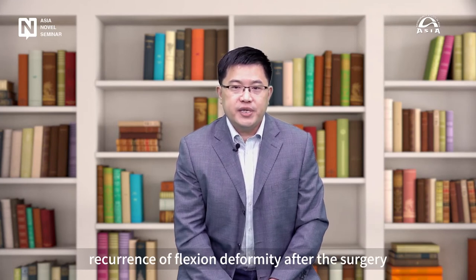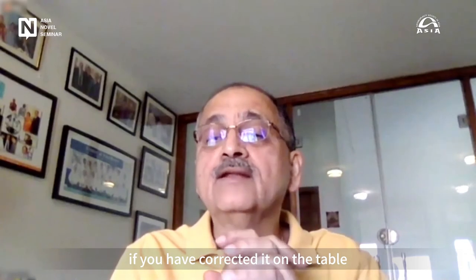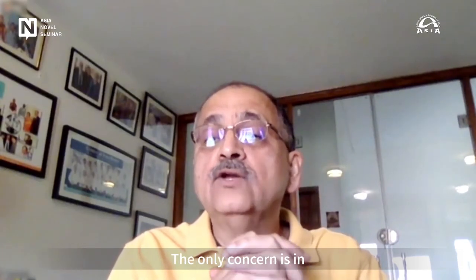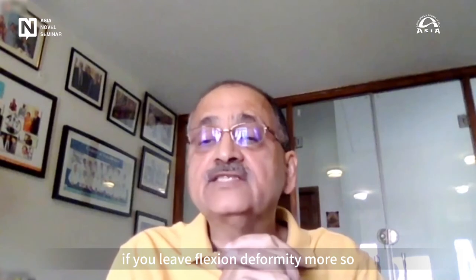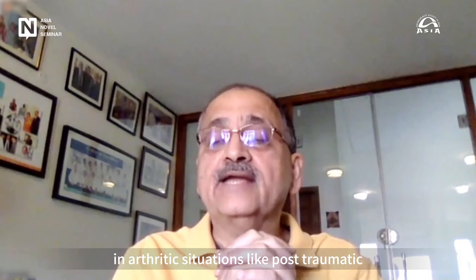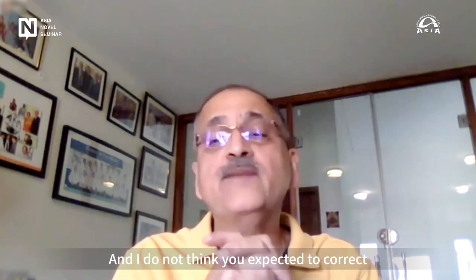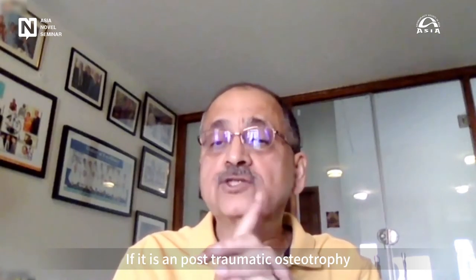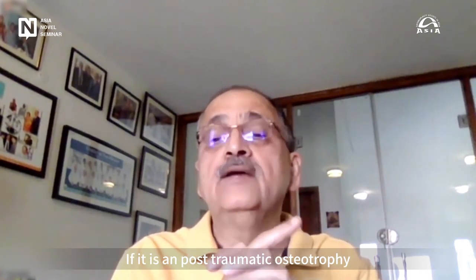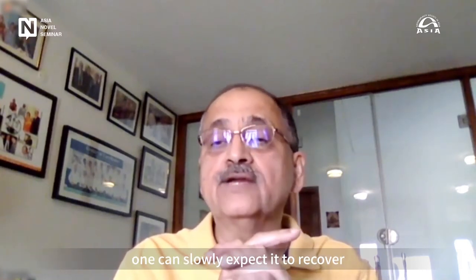How do you avoid the recurrence of flexion deformity after the surgery? The fact is that if you have corrected it on the table, it should not come back. The only concern is if you leave a flexion deformity on the table, more so in arthritic situations like post-traumatic, then you're likely to have it. And I don't think you expect it to correct. It's osteoarthritic, post-traumatic osteoarthritic. Inflammatory arthritis, one can slowly expect it to recover.